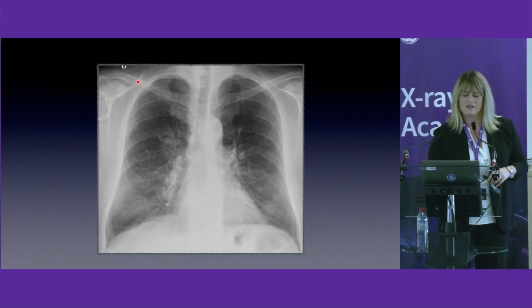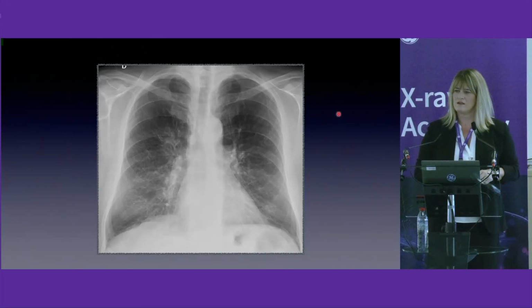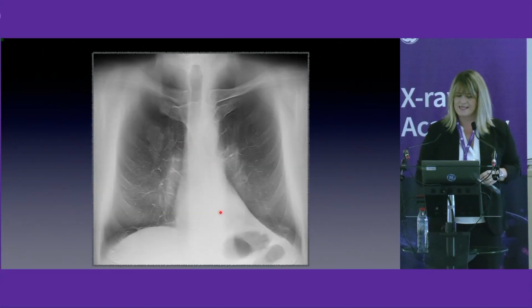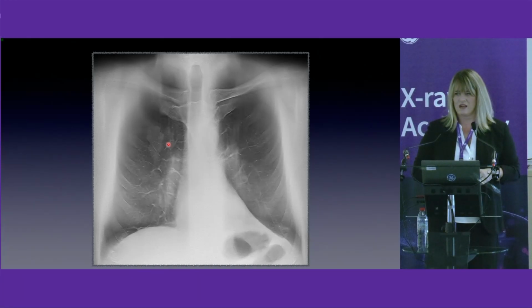Our old patient with calcified cartilage, chondrosternal cartilage. But is there anything wrong with it? Maybe again the hilum. The upper, okay, so we perform DTS. What we can notice here, this opacity in the very anterior part of our chest belongs to a calcified pleural plaque. But if you have any doubt, we still follow up those patients.